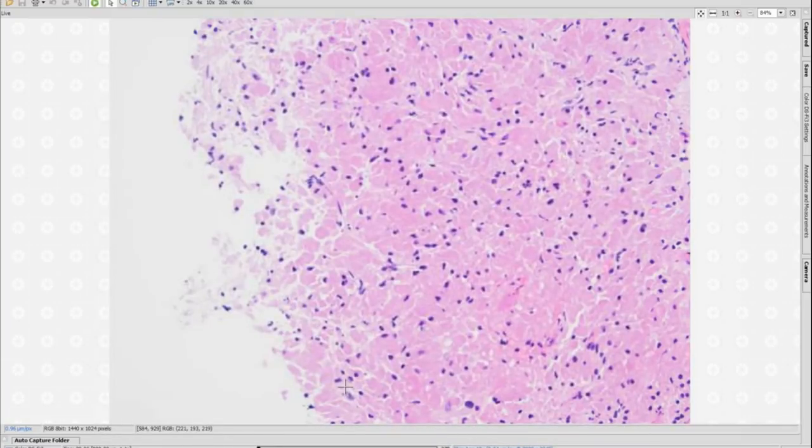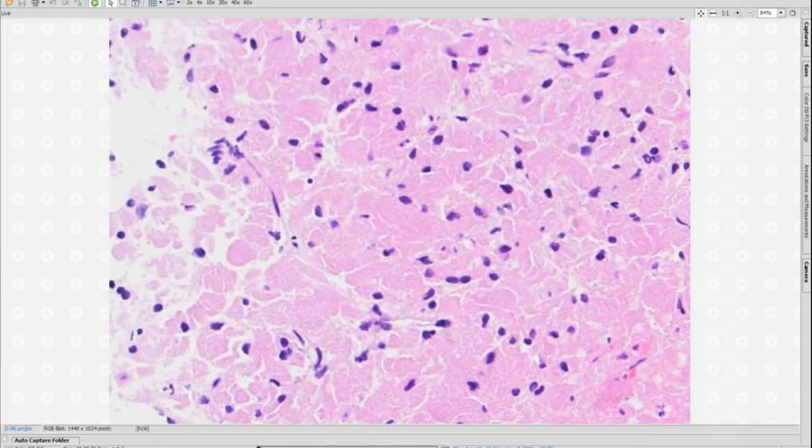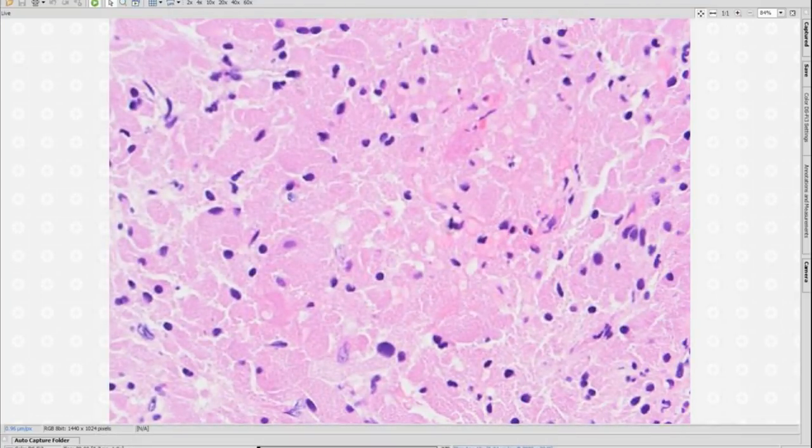And this is the lesion. You can see very bland. In the frozen section, we spent some time thinking about it, because when we saw it on the frozen section itself, you can see it's not that cellular. You have this pink background, and something that you can start thinking about is whether this is something from just the brain parenchyma, and in particular a very tiny frozen section that we had. So we looked at it more and more. We had those clues in the smear, and we were able to make the diagnosis actually of granular cell tumor.